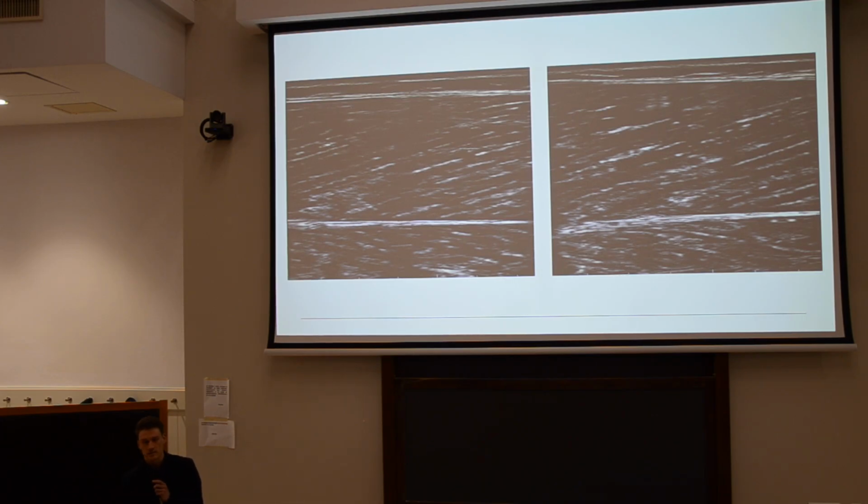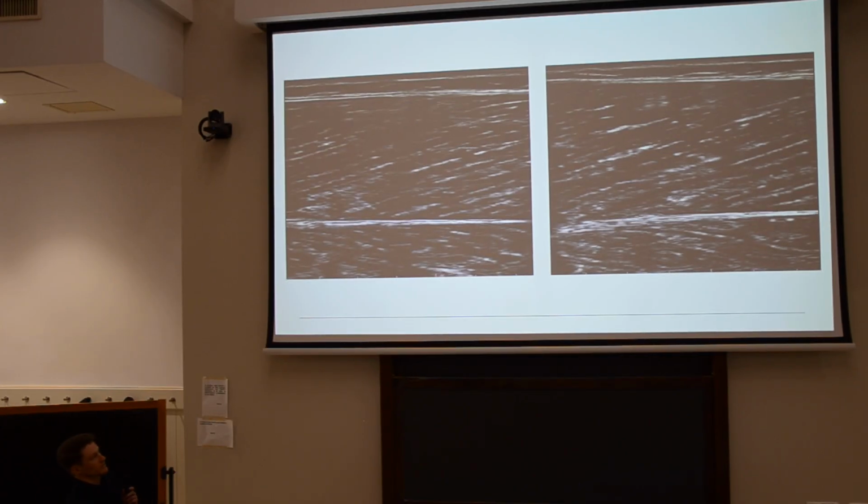But to me, and I would argue it's not really the best images that I could have shown, but they make the point, they don't look too similar. And if you would analyze these images, we would get roughly a half centimeter difference in fascicle length, 2 degrees in pennation angle. And this is, and even more, what we see in the literature as the reliability. So minimal detectable change is about 1 centimeter or below, and pennation angle 2 to 5 degrees. But it would be great if that could be lower.